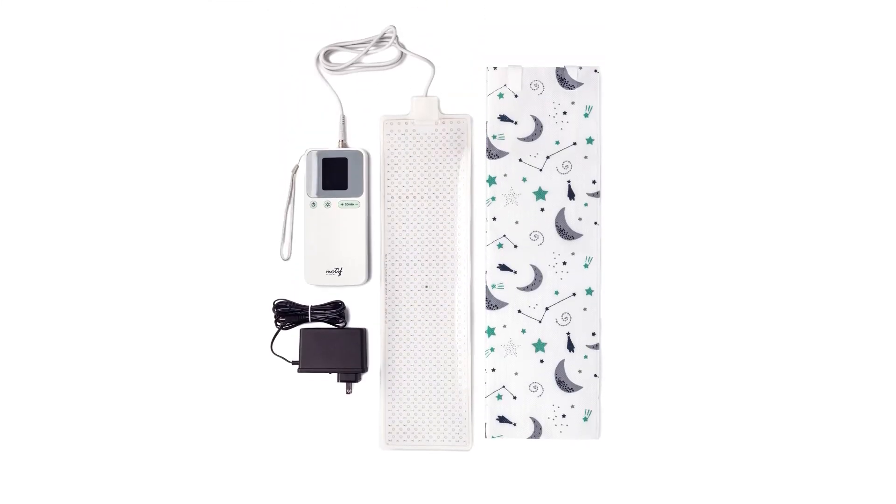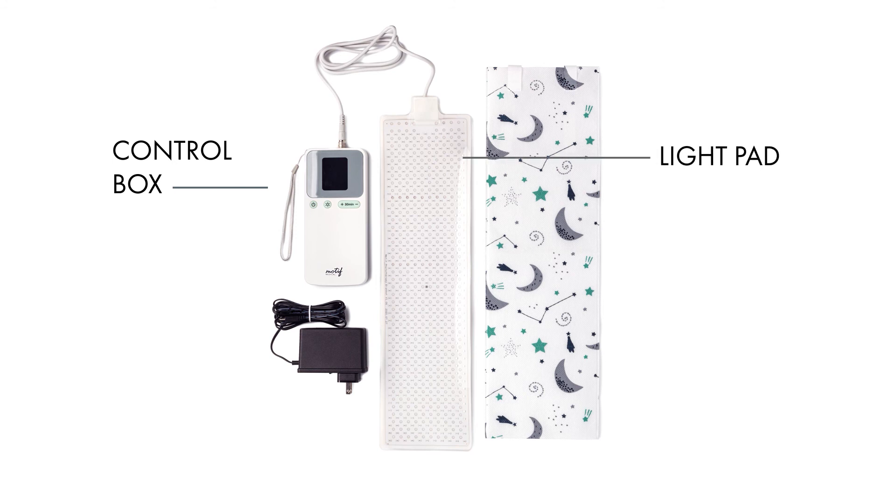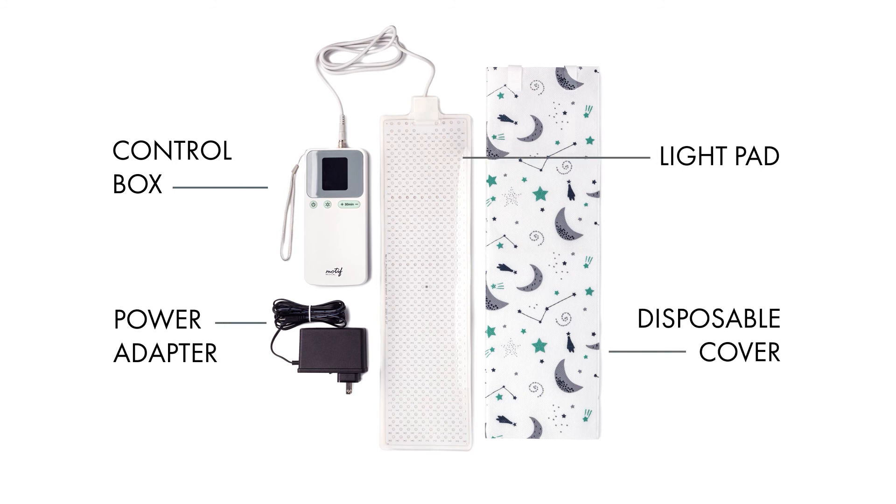When unpacking the Billy Touch, ensure all the following items are included: the control box, light pad, disposable cover, power adapter, and user manual.